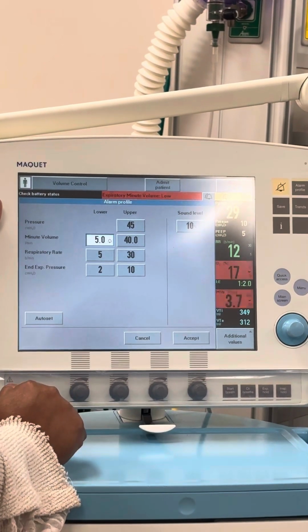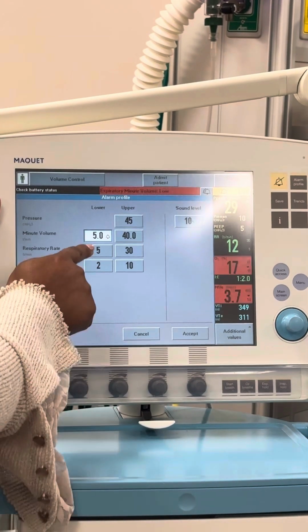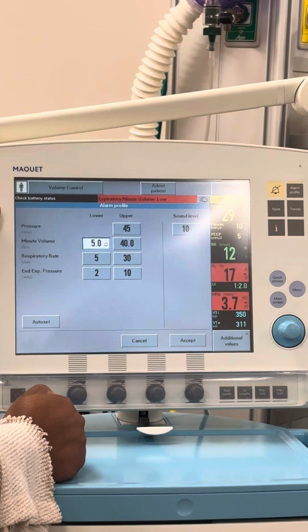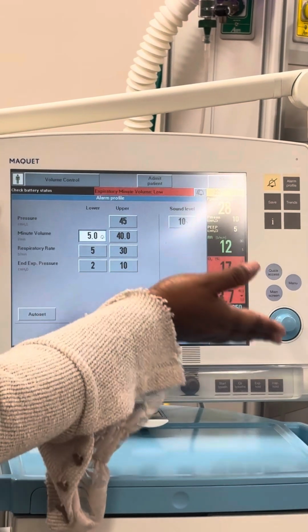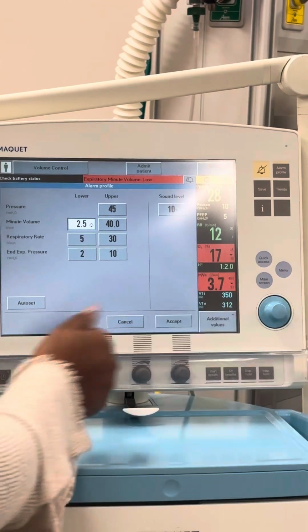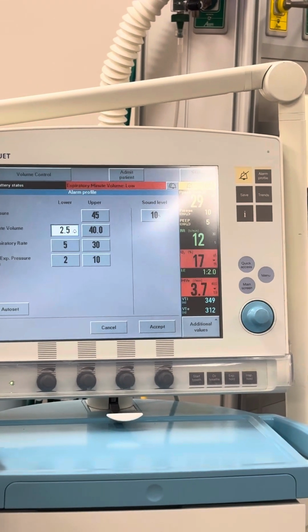So a low would be what? That's why it's flashing, because it's 3.7 and my alarm's at 5. Remember, we usually don't go below 3. In this situation at 3.7, I may go down to 2.5 or something like that. All right, do y'all agree that's okay?